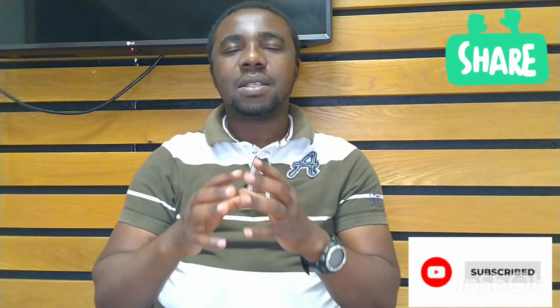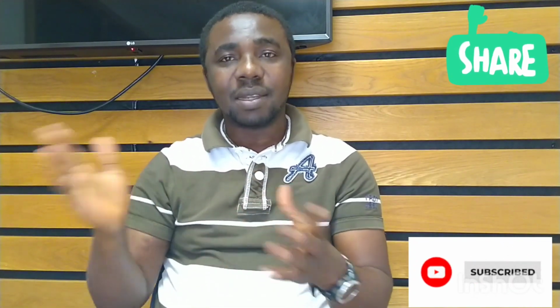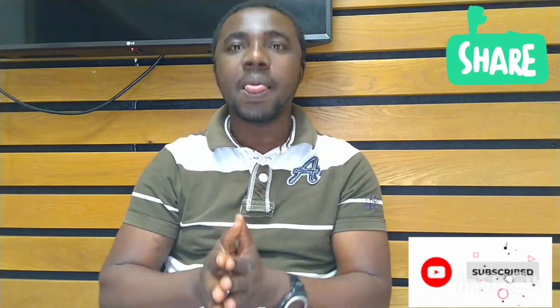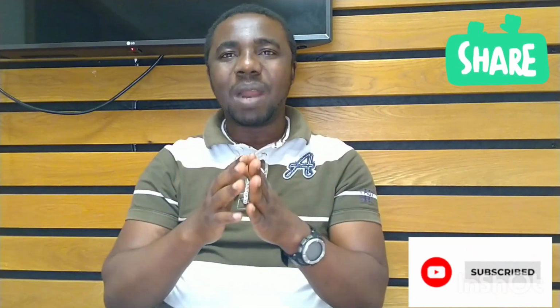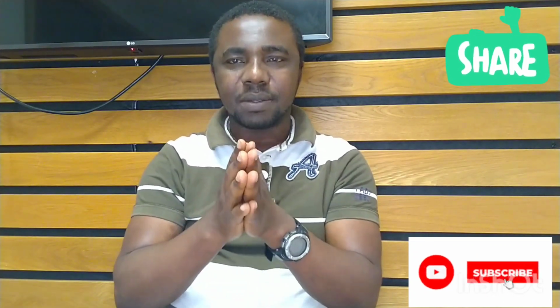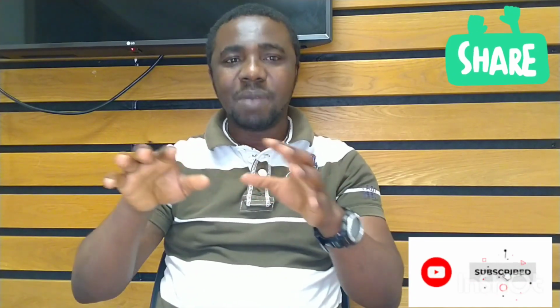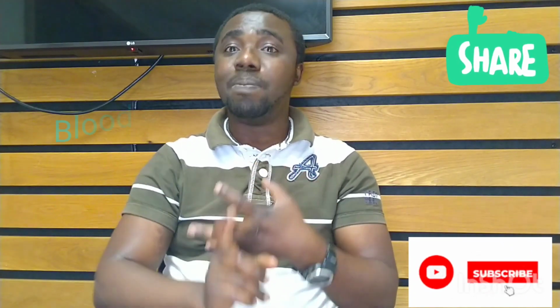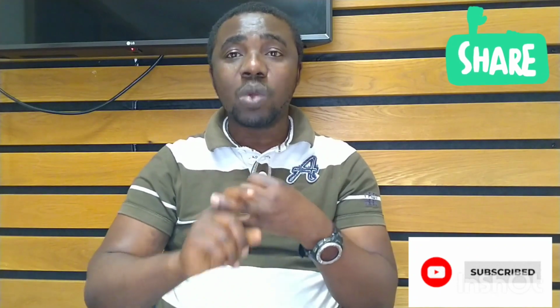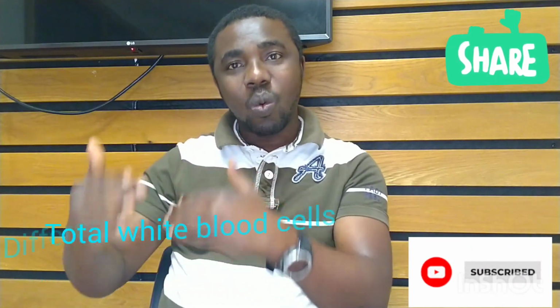When we look at full blood count, which I've just mentioned is going to be the Sysmex XN 9000, 9010, there are so many codes for it. I really want to start off by saying this: there are different channels, or different things that you measure. Remember that in full blood count, you're looking at blood cells generally. You're looking at the red blood cells, the white blood cells, and the platelets. Even when you talk about the white cells, you're looking at the total white cell count, then the differential white cell count.